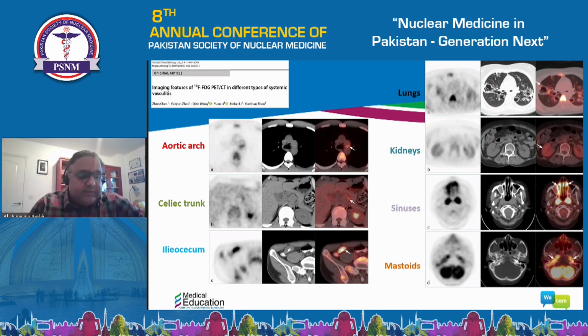So now on this image, I will just mention, I came across a very interesting paper recently looking for something else, and they used the word cartography, which is the science of making maps, and they say there are two cartographic imaging mapping tools to look at a certain disease or abnormality, and they named PET-CT and bone scan for that matter, because that was a whole body scan. So when we are imaging for one particular disease, since we are imaging the whole body, which usually takes from vertex to the upper thighs, we are mapping the whole disease, which no other modality can do in that amount of time. Next slide, please.